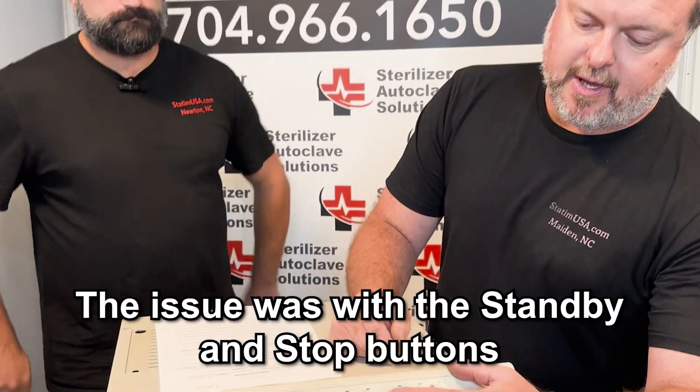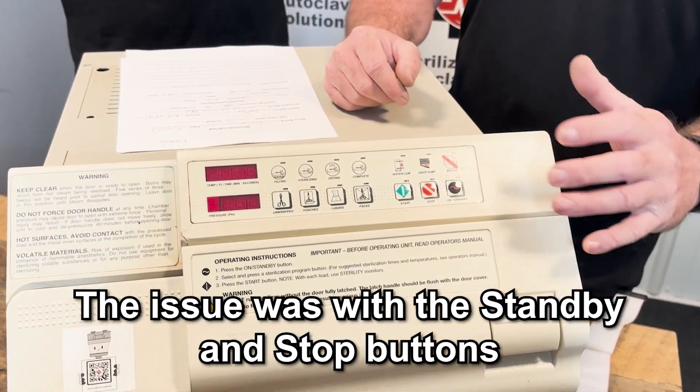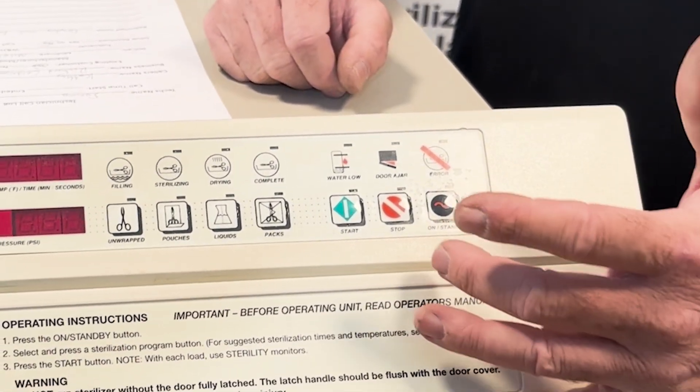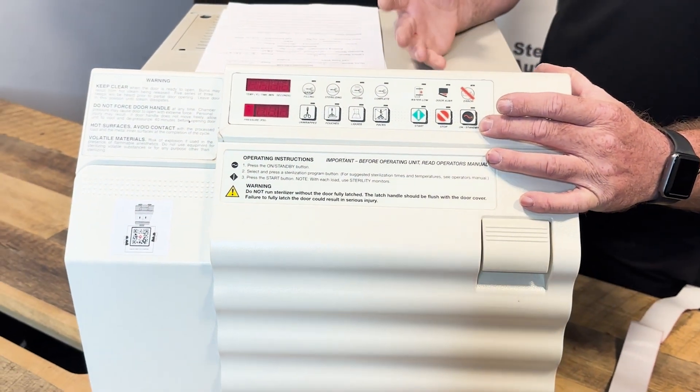Walk us through the scenario here. The customer called in saying they're having some display and keypad issues. This particular customer is having display and keypad issues mainly with their standby and their stop buttons. The standby button is very important because that is essentially your on-off button for the M11 old style. So they were having trouble turning the unit on and getting it ready to start a cycle.